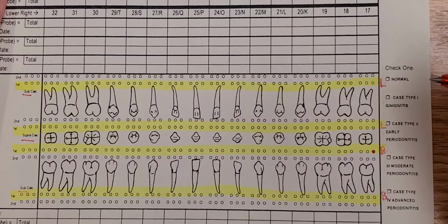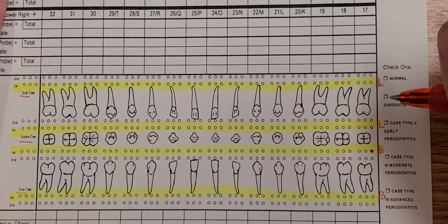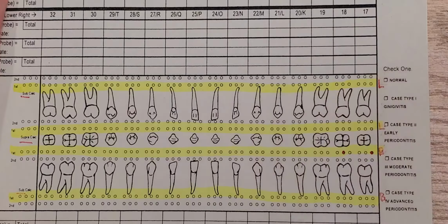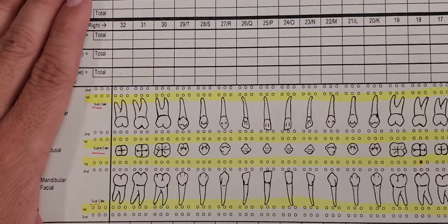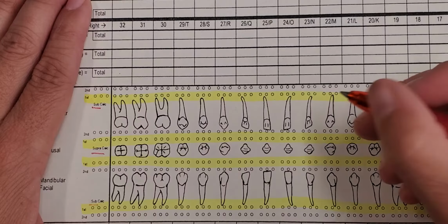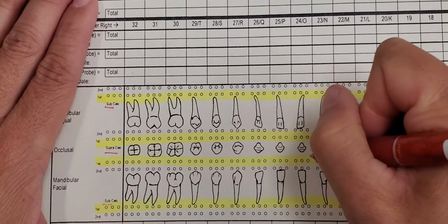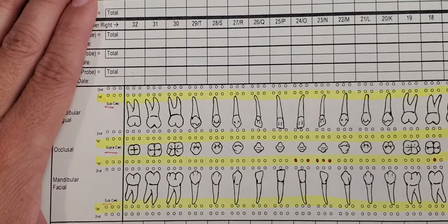Continuing, as long as you and your recorder know you're only talking about supra, you can just call out the tooth number and the site. So 18, straight buccal. It's common to have supracalculus, or more common in the anteriors. So we might say all three sites buccal of number 23. Distal and mesial supra, number 24, facial.